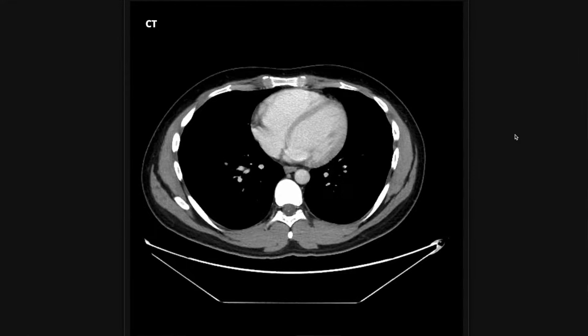Almost always the radiologist is going to prefer intravenous contrast. It helps the organs pop a little bit more — you can tell more about what's going on in the abdomen and pelvis and it helps things stand out that might otherwise be tough to catch. Of course if the patient has an allergy you don't want to do contrast, and in kidney stones a lot of times the recommendation is just a CT without contrast. Generally when in doubt, order contrast; if you have any questions you can always call the radiologist.